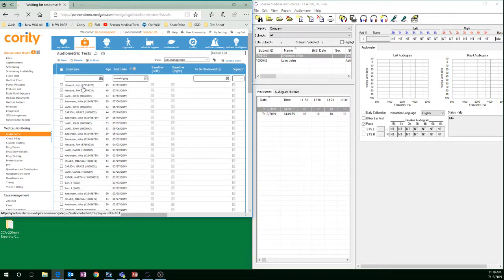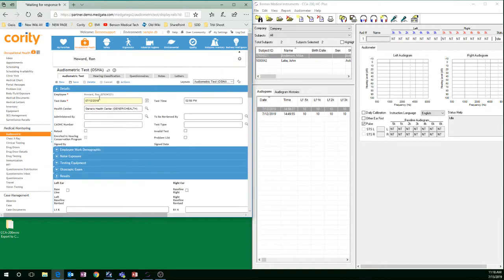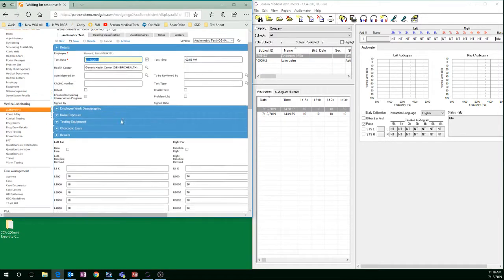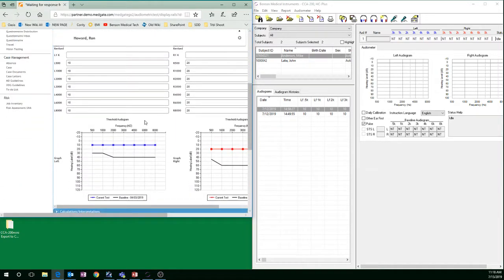I can see those tests by clicking on the subject. And that's how you go from CCA 200 Mini Software into Cority using our Export feature.